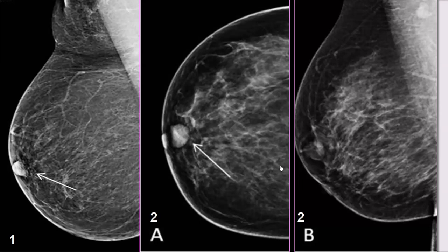Okay. Or a lesion. A lesion. Yes. It could represent, even the asymmetry is a lesion. Yes. It's okay. At this level, I'll accept from you to say a lesion, until we go to the lecture of asymmetries and mass and mammographic abnormality. After that, I'll not accept broad terms. But at this level, I accept from you, you can say a lesion. Yes, that is a lesion. Space occupying lesion within the breast.